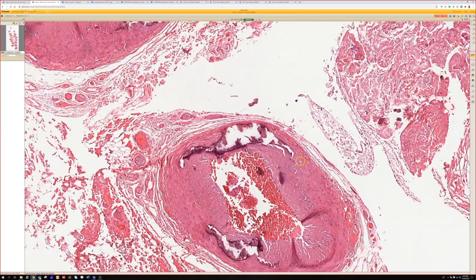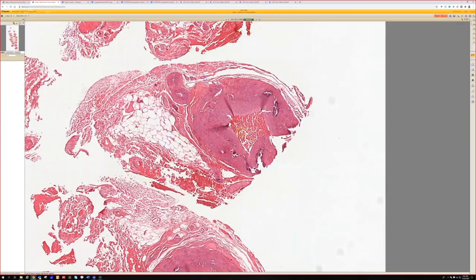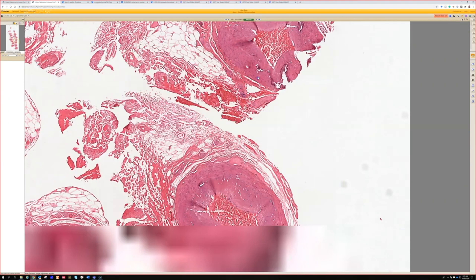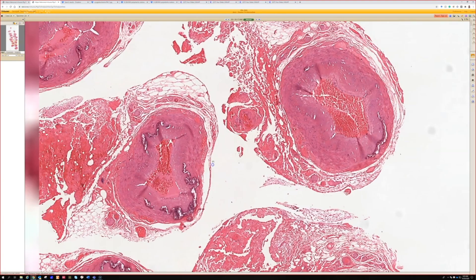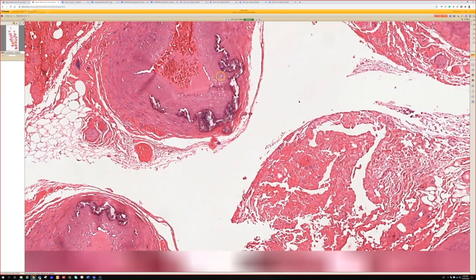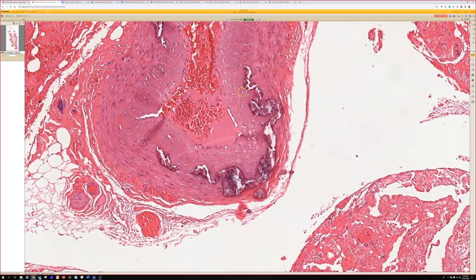It's a little hard to tell here because it's not quite the same purple, but it's like fragments of calcium. So there are calcium deposits, multifocal, and when we look around you can see it's actually everywhere - all these crumbled and breaking up calcium deposits in the vessel wall, located right along the elastic lamina, which is interesting. I've seen this before in the temporal artery particularly - it's almost like the elastic lamina is getting calcified.